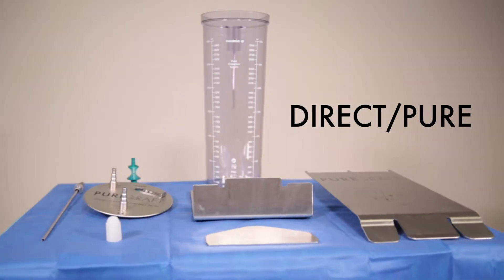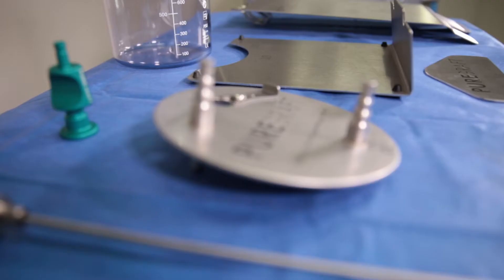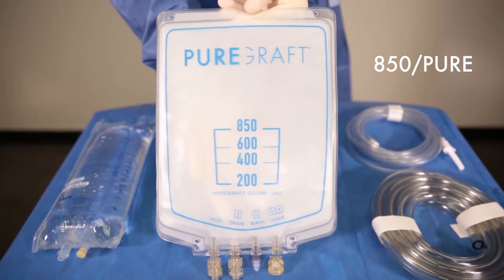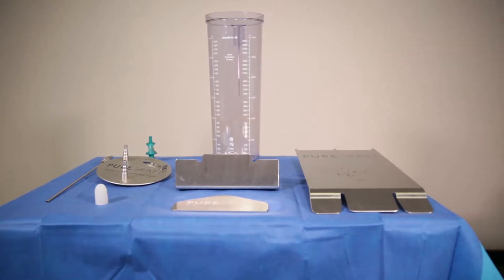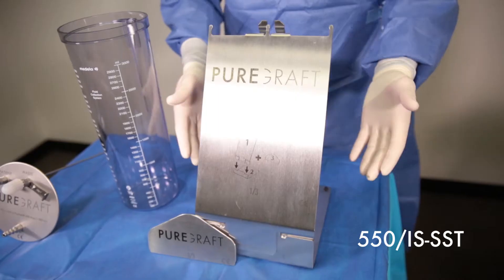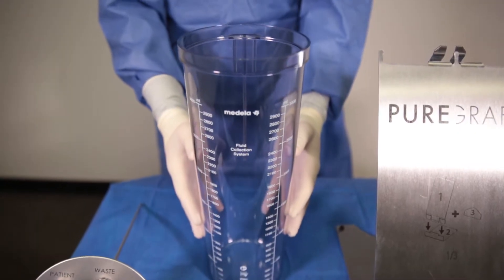The PureGraft Direct Harvest is a reusable system, making it possible for the user to harvest lipoaspirate directly into the single-use PureGraft 850. The Direct Harvest system is comprised of three core products: the PureGraft vacuum lid, the PureGraft easel and slider, and a 3-liter Medela canister.